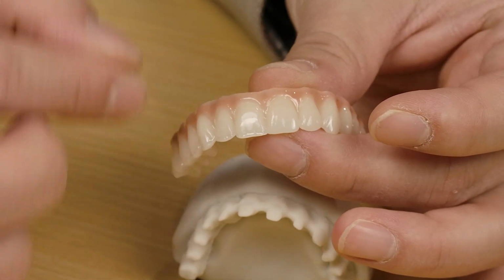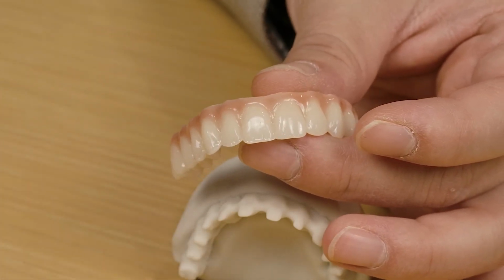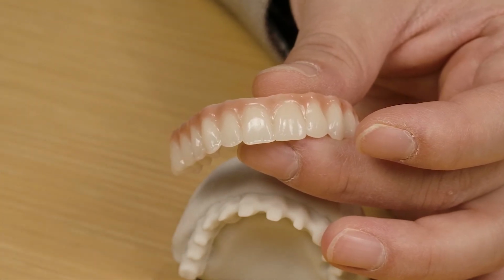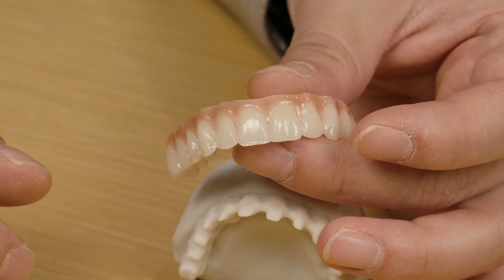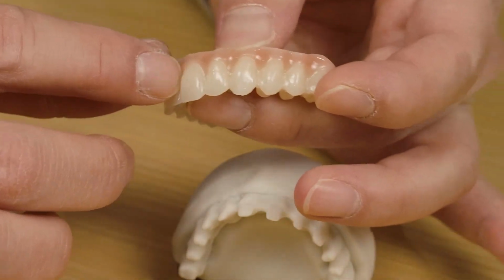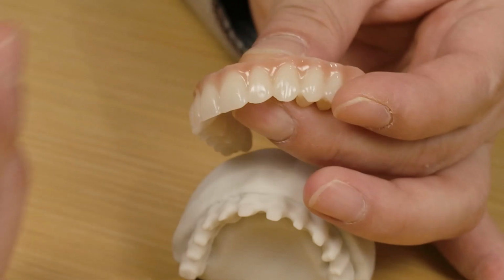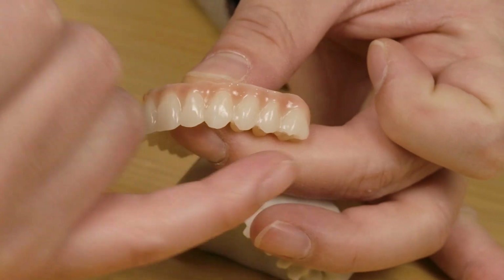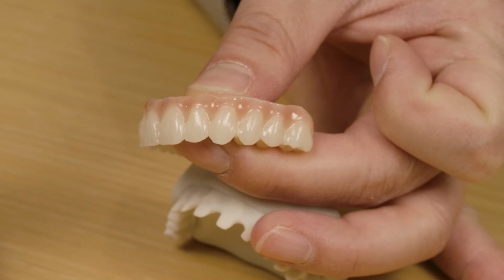And once the buildup is done, I do minor contour and do, once again, going back to CZR stain paste and do external. I could use clear glaze and maybe give a little bit more stains to highlight. And in that sense, when it's not cut back with the STML Katana Zirconia, we'll also be able to create reasonable aesthetic. So, this from number 9 through number 14, these were non-cutback, stain only results.